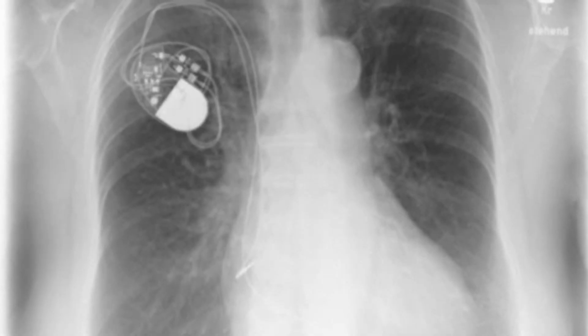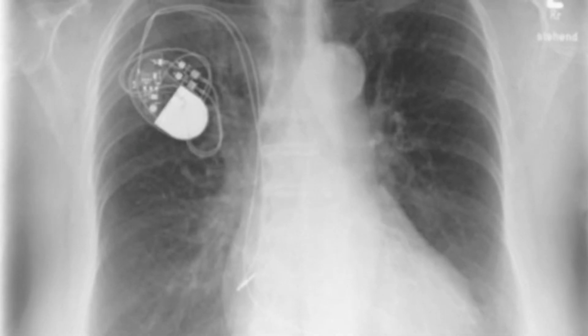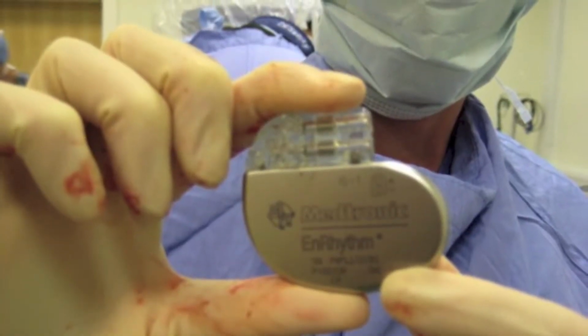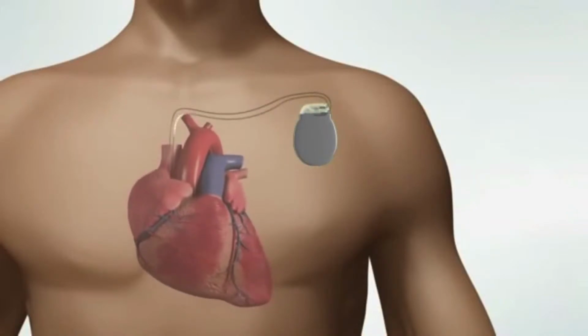Innovation throughout the years has now led to the development of small dual pacemakers and defibrillators. So that big dual pacemaker and defibrillator you saw Mr. Bean holding can now be shrunk down to 2 to 3 inches and be placed inside you if an abnormal heart condition persists. It would then be able to pace the heart and even shock it in the event of an arrhythmia.